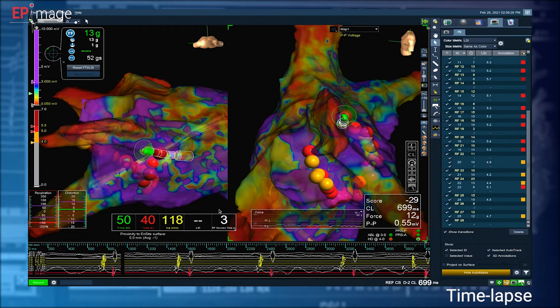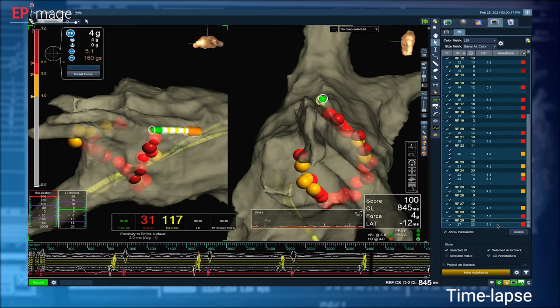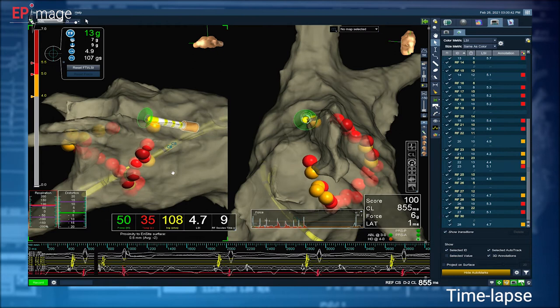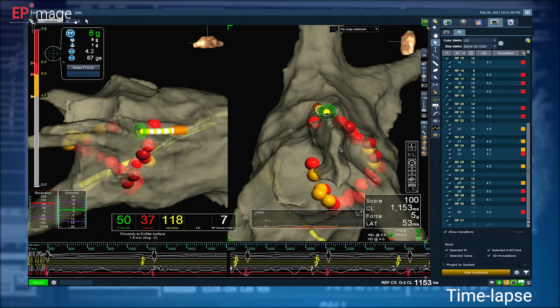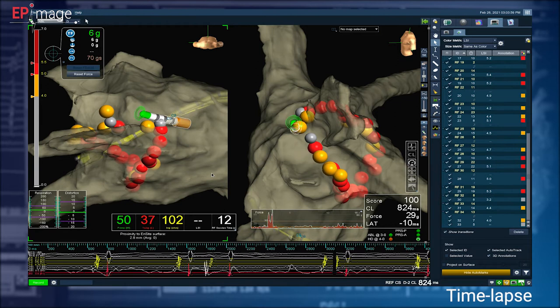What we experience in this patient is the problem with very deep breathing and a patient not very compliant with our request to stay calm and keep his breathing as shallow as possible. But still, it happens, yeah. So what can you do? You have to work in the environment.